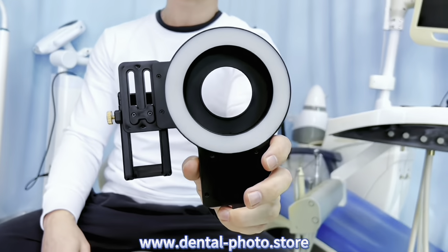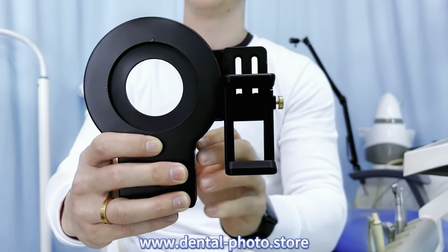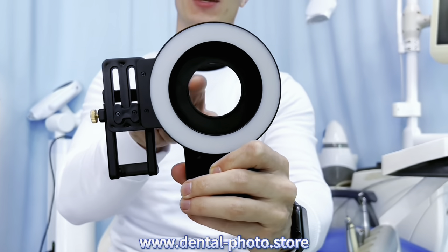Hi, it's Nick and I want to introduce you to our new revolutionary product for dental photography. This is MK23. This is indeed the best product for dental photography ever, and this is why there is the phone clip at the back which is adjustable, so you can adjust the position of your phone as well as the position of your phone camera to be right in the middle of this ring light.